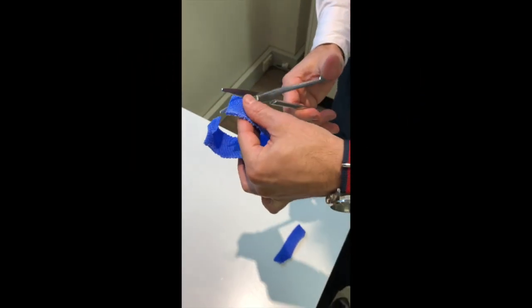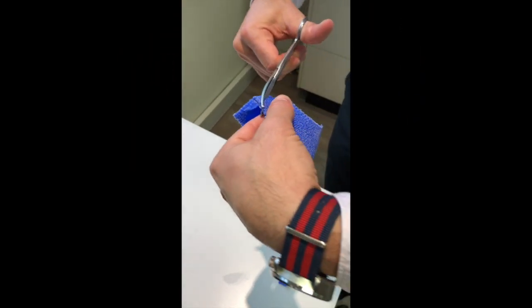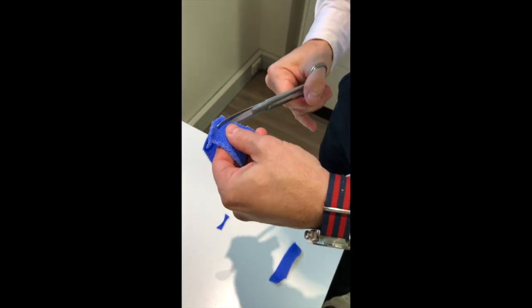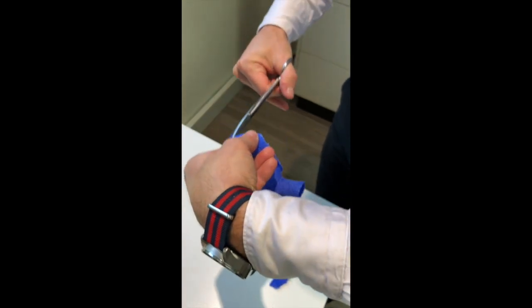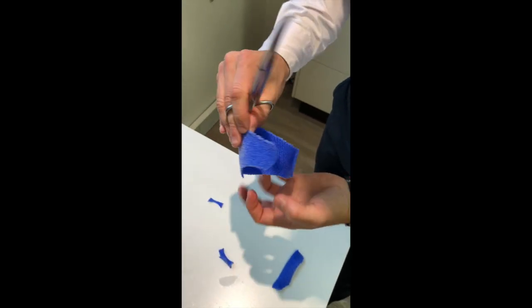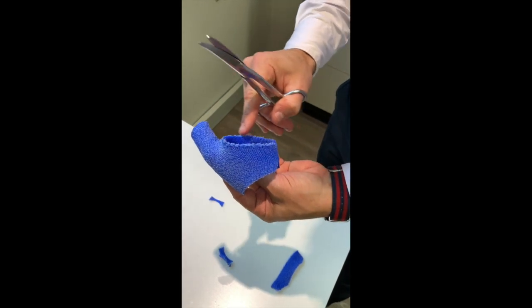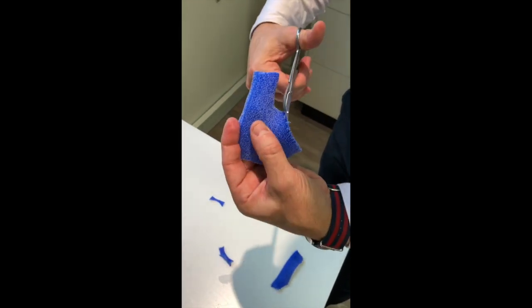I'm just fine-tuning our splint now. We want to cut off all the sharp edges to get our final shape. This part is going to be where our velcro loop attaches to our velcro hook. You can see that some of these edges as they dry hard are actually quite sharp, so I tend to go around and cut all those off.